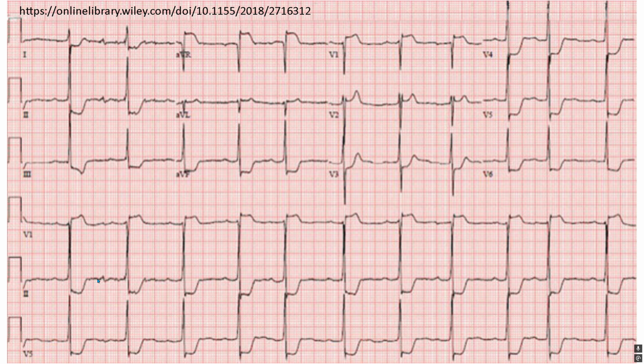Again, here's an example of real-life evaluation, and let's go through it. Well, let's just do the whole thing, okay? So for the rate, I don't think it's fast. For the rhythm, I do see 1 P for every QRS, so it's a sign of maybe a first-degree AV block, but who cares? For the axis, it's up in 1 and up in AVF, so normal axis. For the intervals, I do not see any prolongation of the QT, and the T wave does not fall halfway between each QRS, so I see no prolongation.